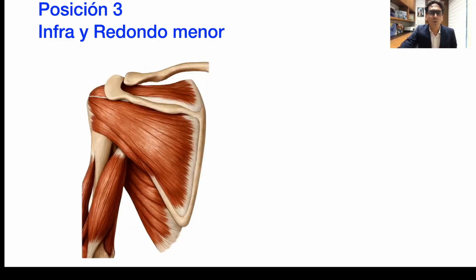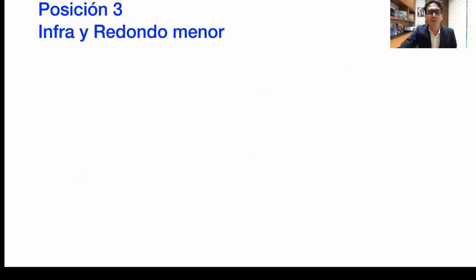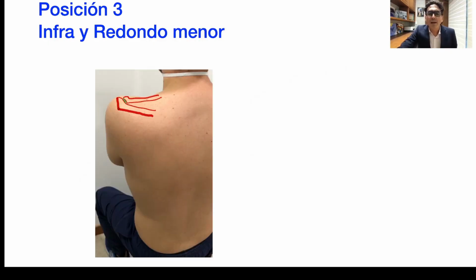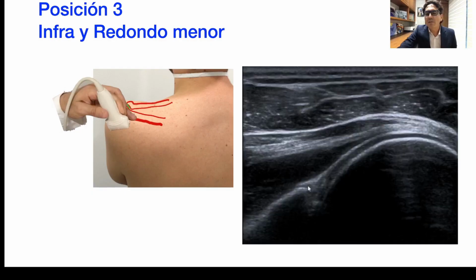Basically, we are going to locate the teres minor after having evaluated the infraspinatus in the same position, where we just assessed this entire recognizable segment: the glenoid, the labrum, the articular capsule, and in our anatomical axis, we are basically going to identify them in the long axis. We are going to emphasize position 3 with our probe in the long axis relative to the infraspinatus.